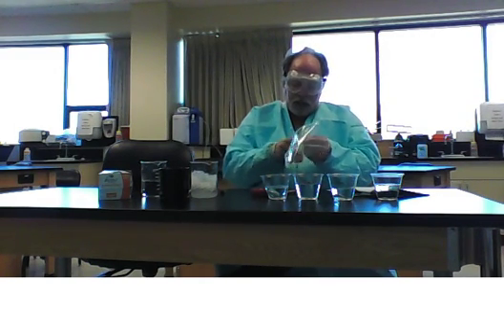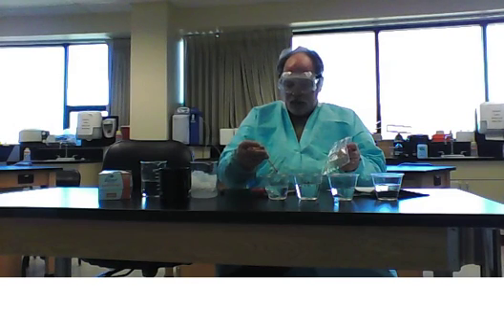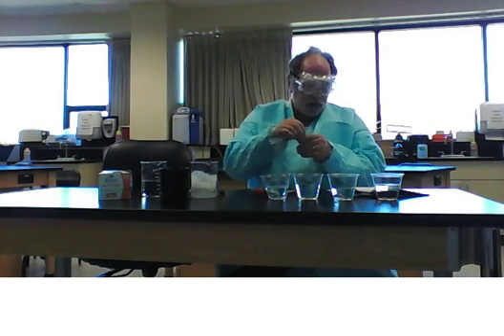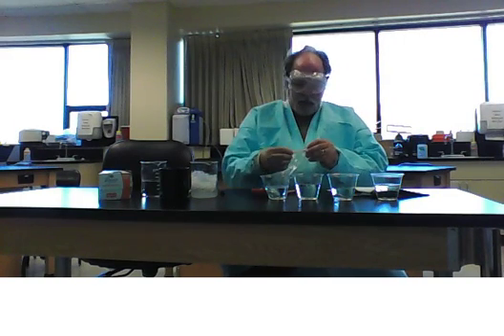Okay, it's a good idea to note the initial temperature on the thermometer, which is 20 degrees, which is room temperature in here. Place the thermometer in a baggie. Okay, and then reset your timer, and then place it under your tongue for 1 minute.